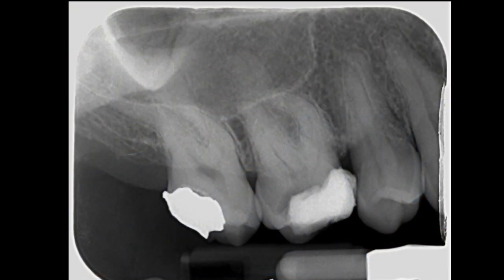In this video we're going to be looking at locating canals. We're going to be hunting for the MB2, but the case has a little twist because there's not just one, not just two, but three MB canals. And that's all very well - you may be able to find the orifice, but what do you do with it then? So I'll also show you how I negotiate these canals, prepare them ready for disinfection and obturation.